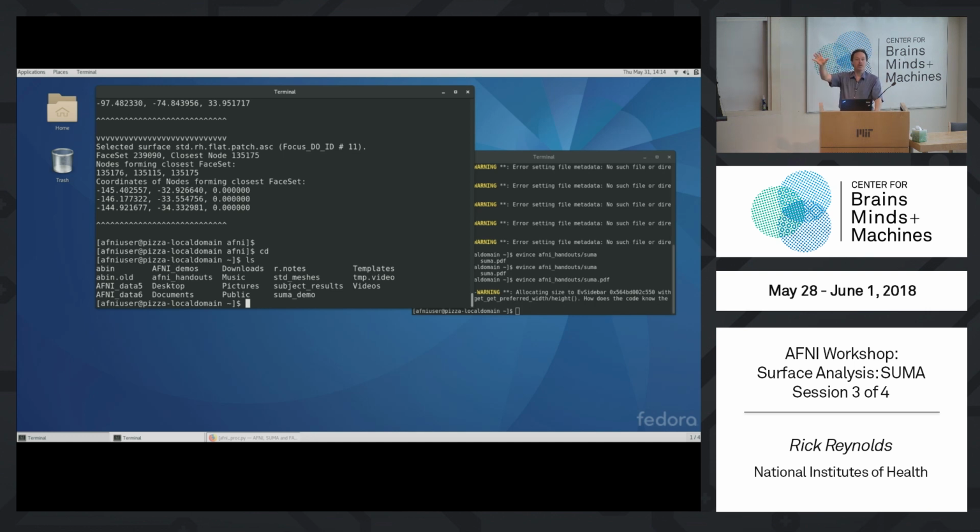Assuming you do a good job with that, now when you blur on the surface, you're in gray matter with gray matter. You're not mixing in the white matter. You're not mixing in the CSF. There's limited corruption of your gray matter data, assuming you do a good job with registration. Not only do you blur on that, but you cluster along the surface too. So you separate the tissue classes that way. So there are some good benefits.